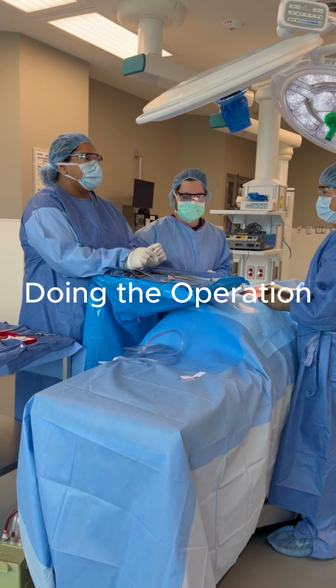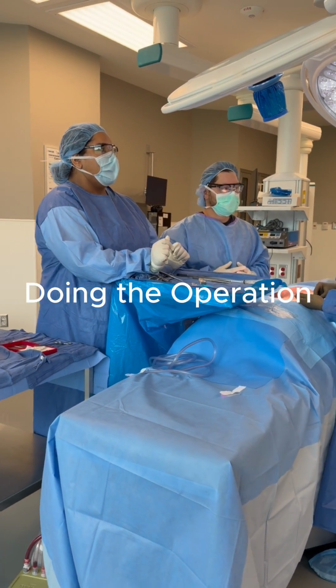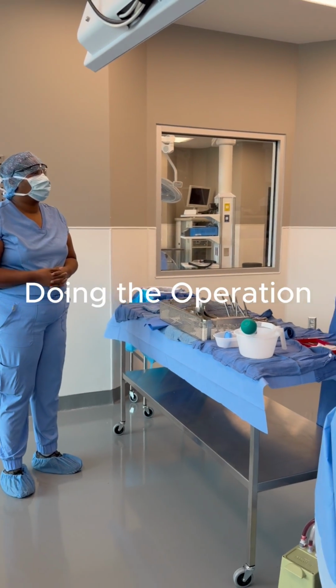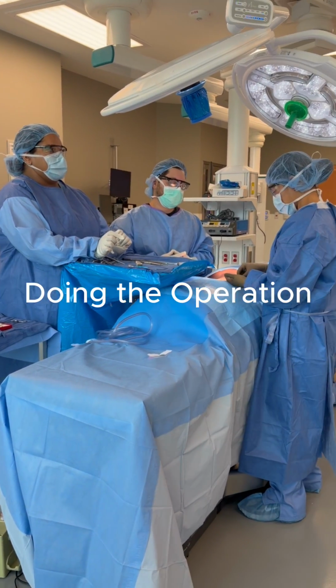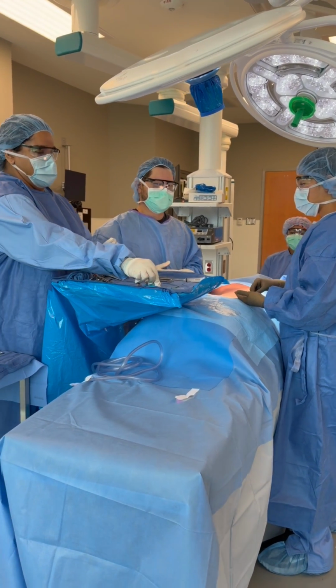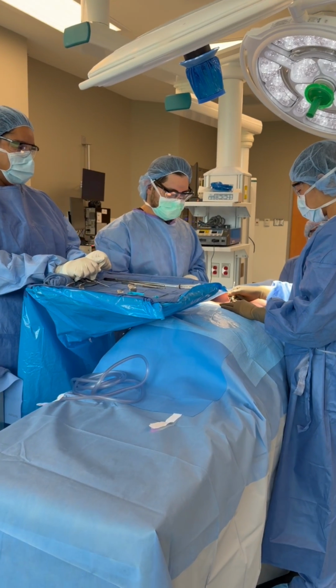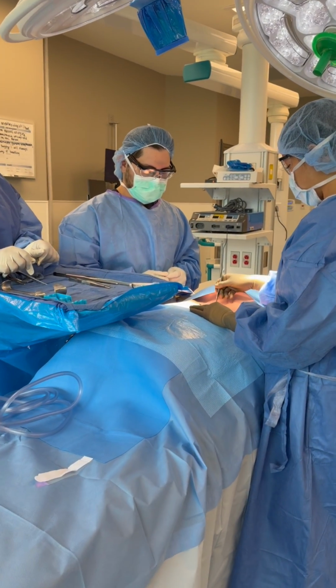Time out. Today we're doing an abdominal hysterectomy. Our patient's name is John Smith. Our surgeon is Sandra, and there are no known allergies. Their birthday is 8/17/1945. Alright, nice. Okay, so then we're going to do a midline incision, so it's easier to remove the uterus and the cervix.